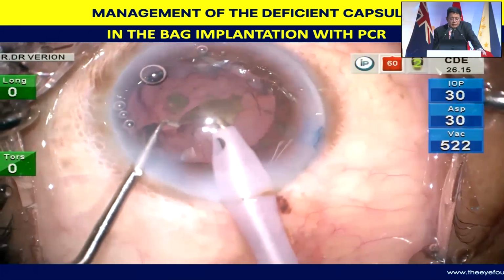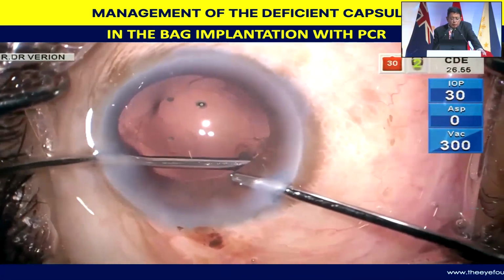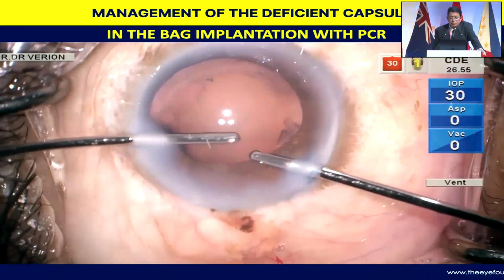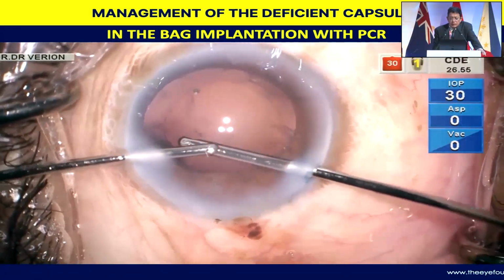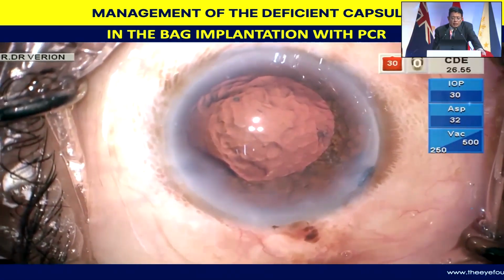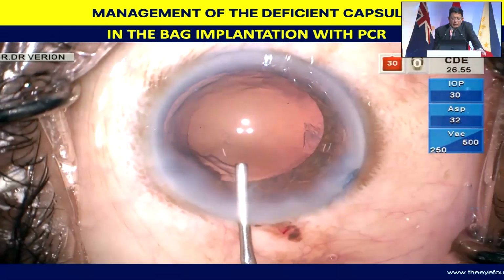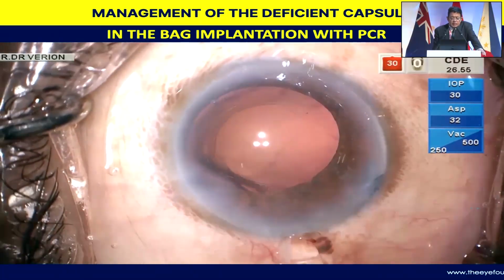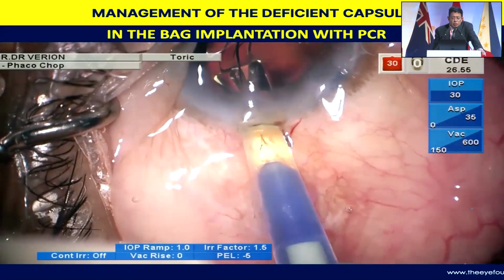But then, as I proceed with the surgery, as was pointed out earlier, there was a surge, and I do have a PC rent, which will become a little more obvious. It's right over here, and you can see in this area. And essentially, without the chamber collapsing, I inject dispersive viscoelastic to tamponade the anterior vitreous space. Then subsequently, the vitreous has not yet presented. I inject more of HPMC on top of it.